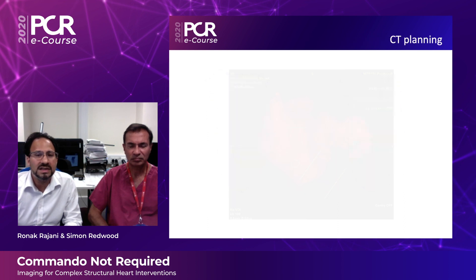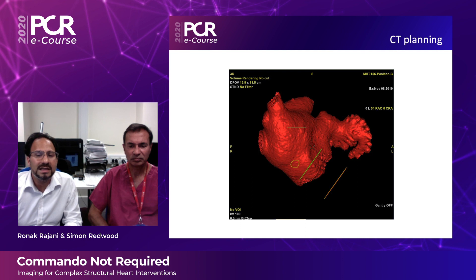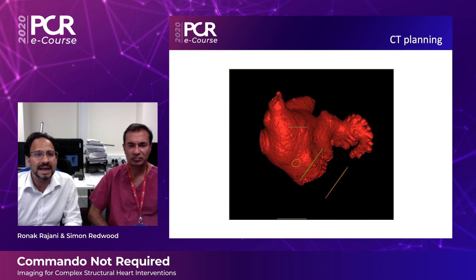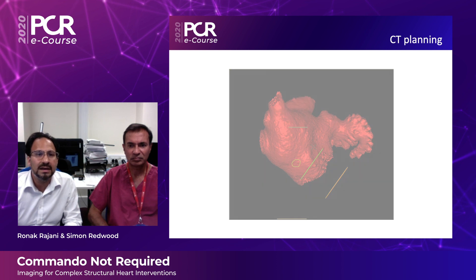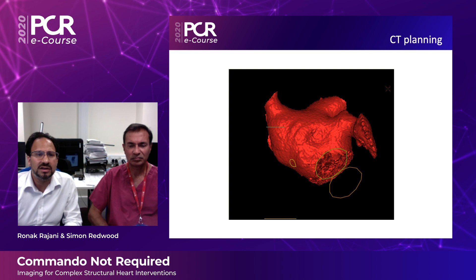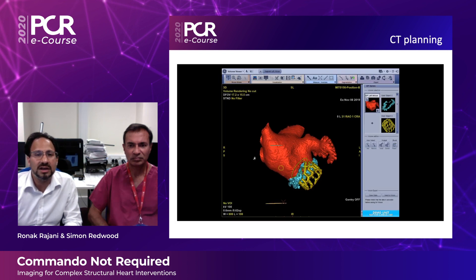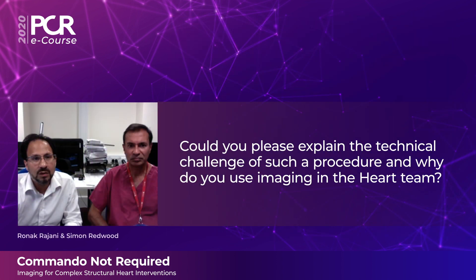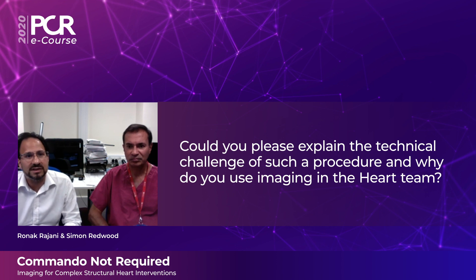The third step in our imaging planning is to take the CT scan data set, perform segmentation, and draw planning lines on the GE Valve Assist 2 platform. This then enables the interventional cardiologist to have live CT-guided fluorofusion to guide the procedure at the time of implantation. We're now going to move through the procedure where Simon will take you through the actual steps.